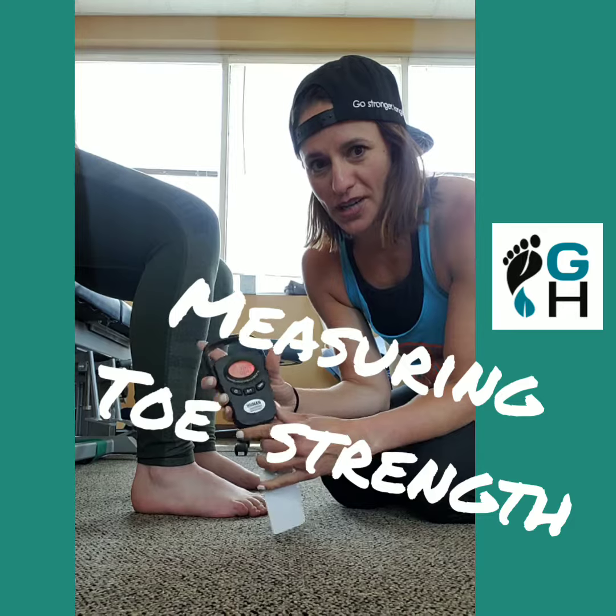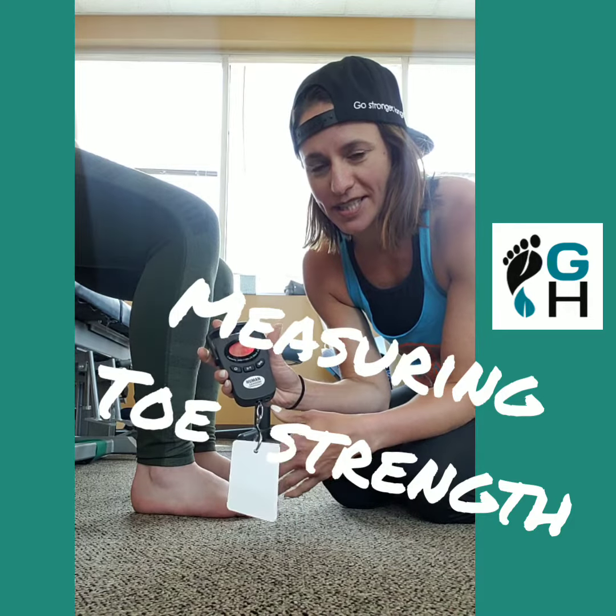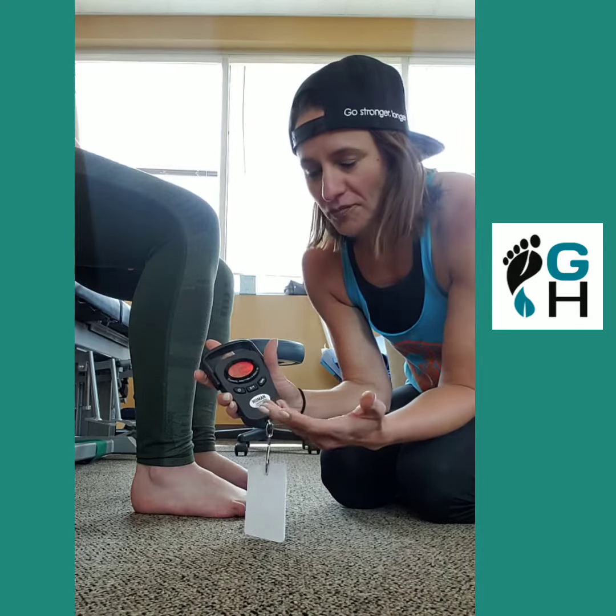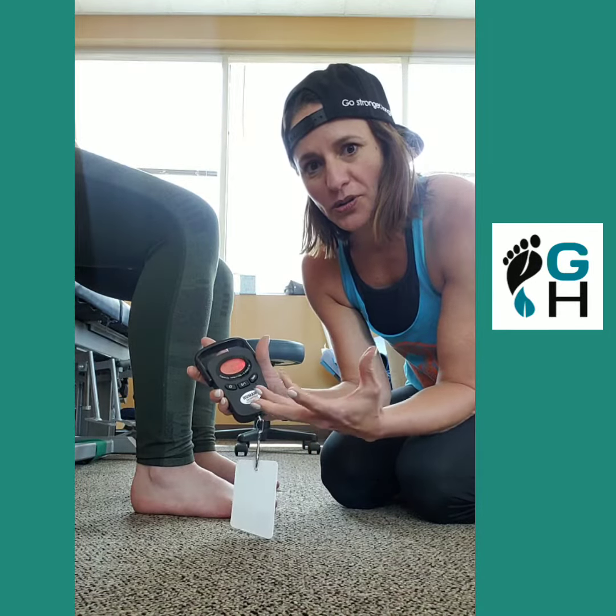This is the toy that we've been playing with, courtesy of Tom Ashad, and what this little device does is really cool. It measures the strength of the flexors of the foot, and we know how important those are for things like plantar fasciitis, Achilles tendonitis, you name it.